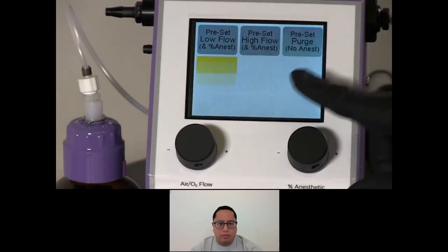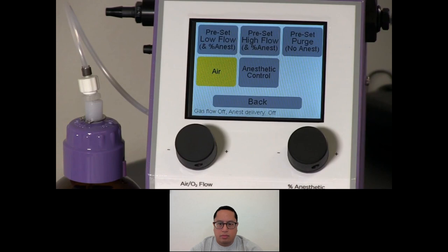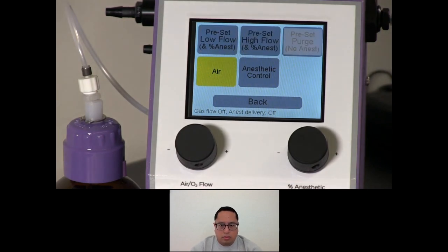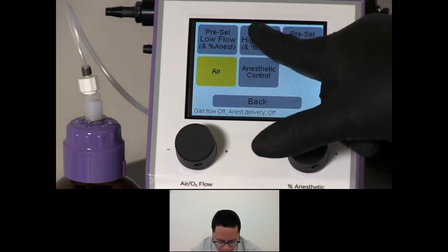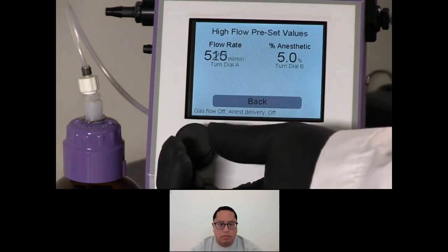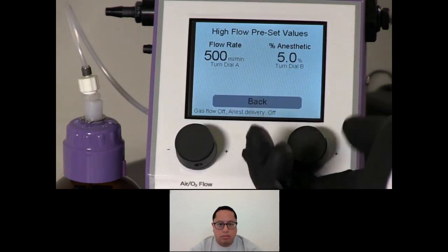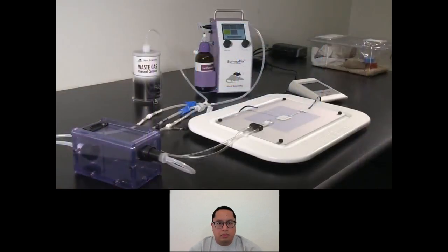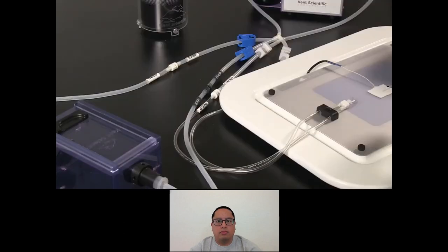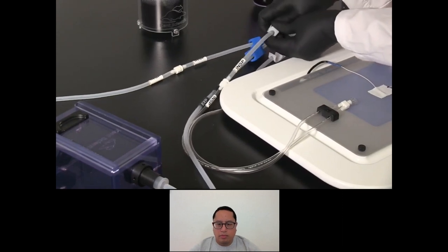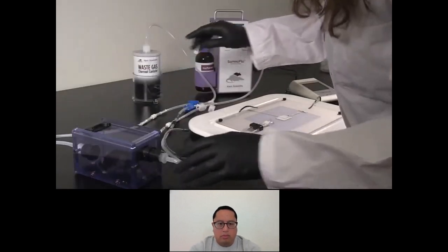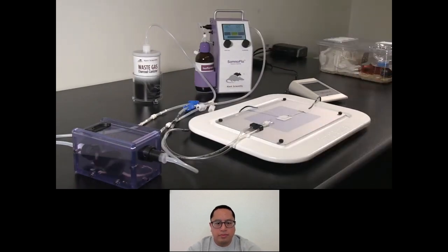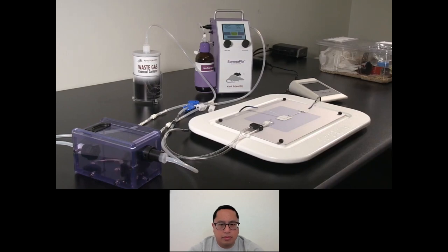Once priming is complete, touch Menu to enter the preset settings. There are three presets available to save your preferred settings: Low Flow is best used for anesthetic maintenance, High Flow is best used for induction, and Purge is best used to reduce excess anesthetic in the induction chamber. The SomnoFlow will save all of your settings, but you can return to this menu at any time to adjust the preset options. Even though you have entered flow rates and anesthetic concentrations for each phase, you can still adjust these parameters during anesthesia delivery from the run screen. Now that your tubing is set up and settings are saved, you're ready to begin anesthetizing an animal. Adjust the clips to direct airflow to the induction chamber. Place the animal in the induction chamber and touch High Flow. Use the dials to make adjustments to the flow rate or anesthetic concentration as needed.